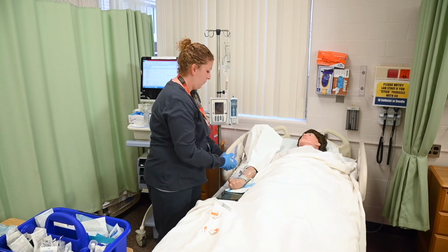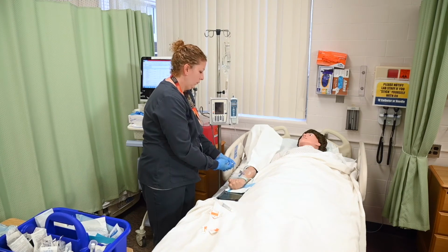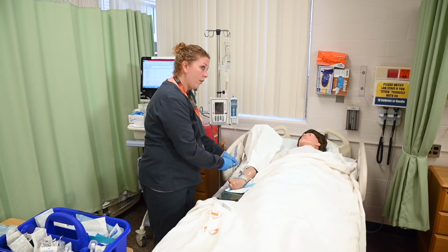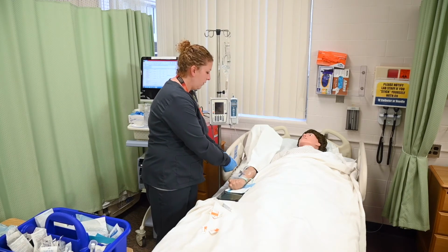Inject the medication within the amount of time recommended by the drug reference manual at 15 or 30-second intervals. Use a watch or clock to time the administration. I'm using the clock on the wall, and I'm pushing 0.6 mLs every 30 seconds. Observe for adverse effects and infiltration with each push. The medication is now completed.